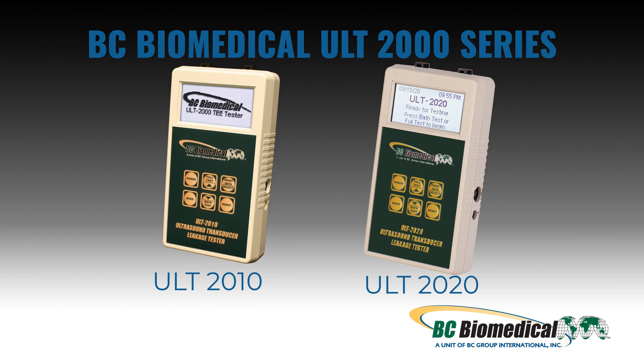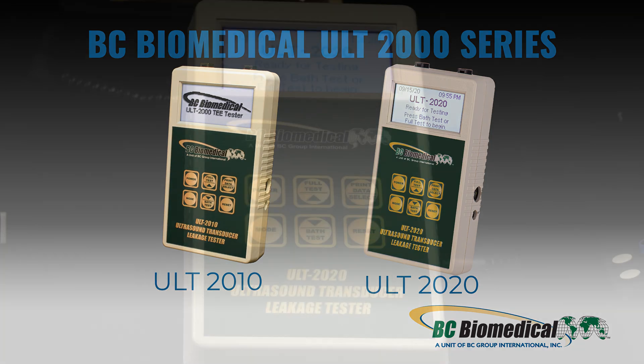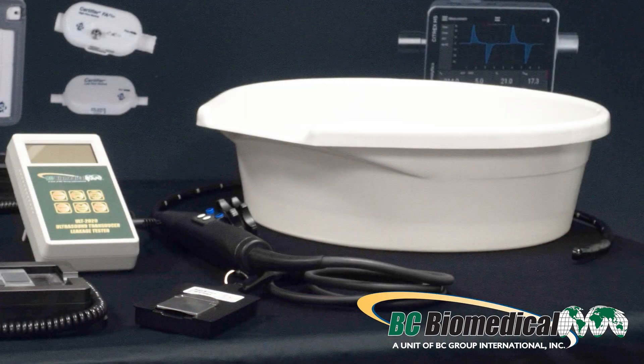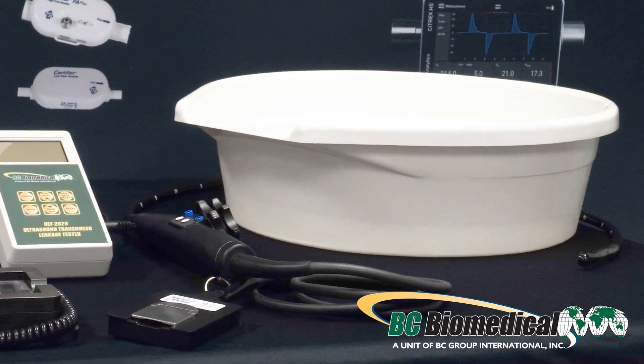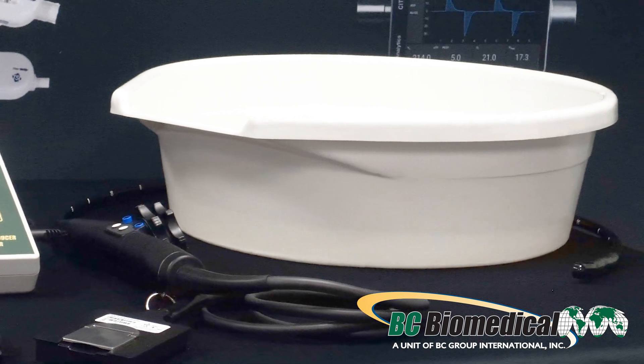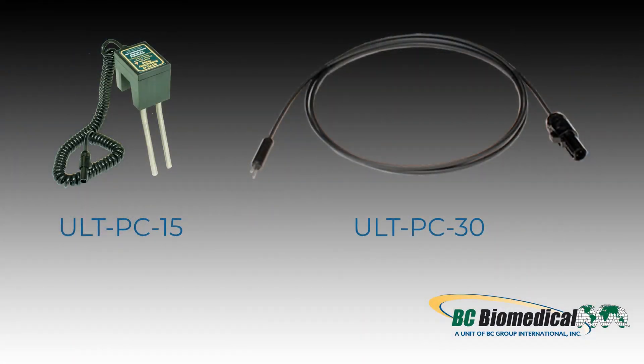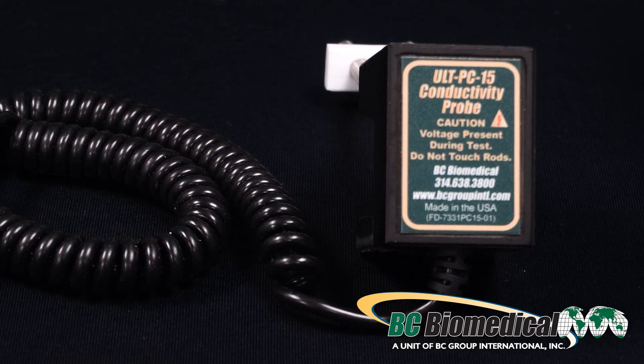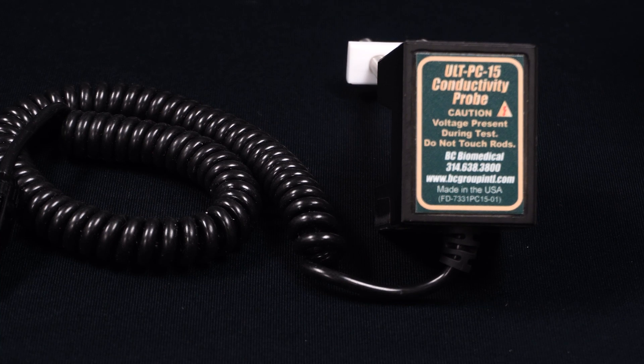For this ultrasound probe leakage test utilize either the BC Biomedical brand ULT-2010 or the ULT-2020 leakage tester. We will be using the ULT-2020. For soaking utilize a soak tray, soak tube, or Astra. We will be using a soak tray. For the conductivity probe you may use the ULT-PC15 for the soak tray or the ULT-PC30 for either the soak tube or Astra. For this demonstration we will be using the ULT-PC15 dual conductivity probe.